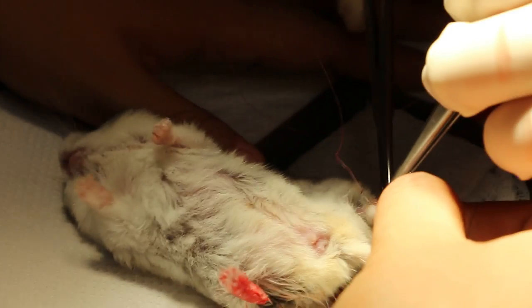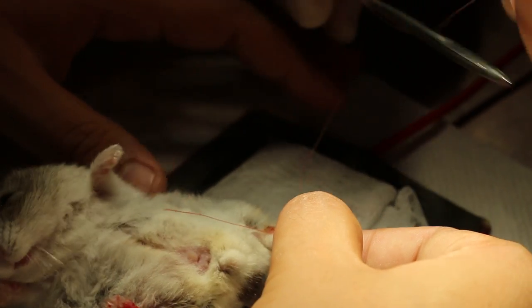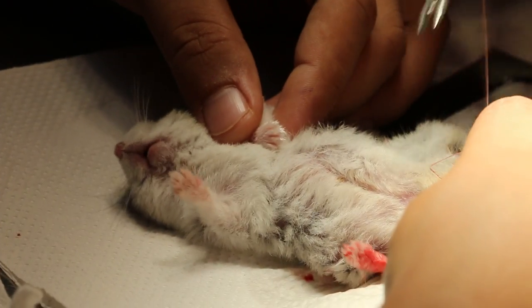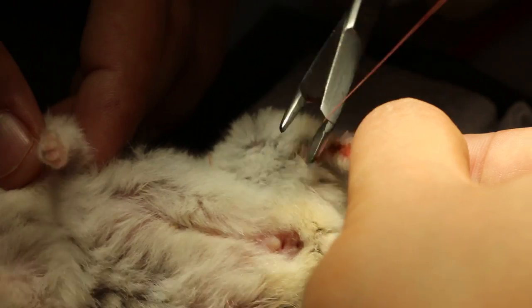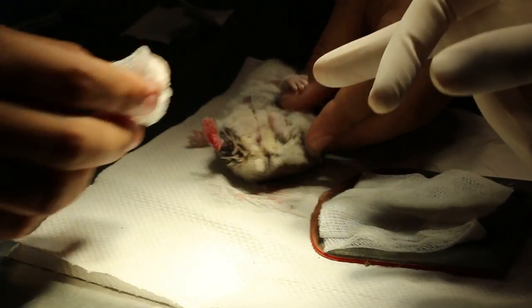Still good energies here. So speed, accuracy and completeness are the three hallmarks of a good surgery. You can see the hamster is still safe. Not heavily sedated. But it's waking up soon, yeah. Okay, ready? All finished. So the time of completion 4:24. Okay, end of surgery.